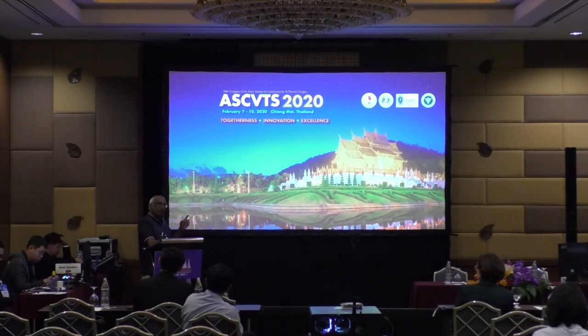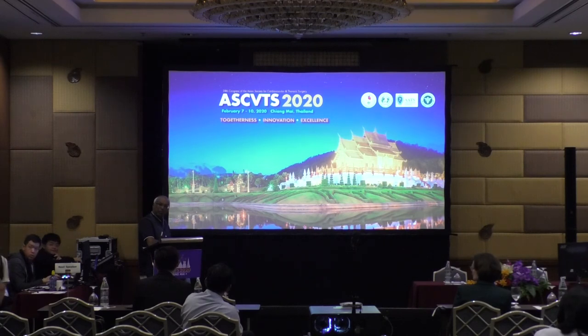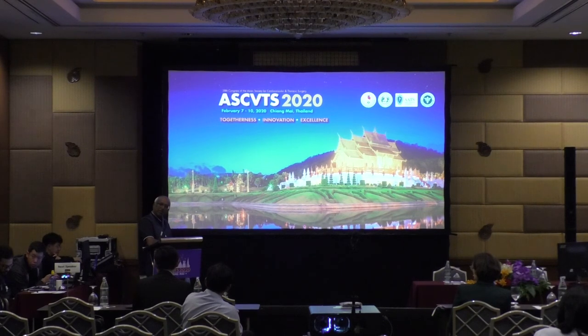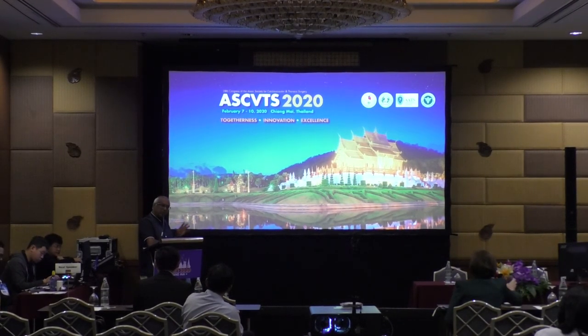I think your last three slides were more important than all the first 10 slides. The reason I say that is, it is so important to understand that strain is very variable. It's not that easy. You move those regions of interest a little bit, you get a different number, right? So I think your last three slides are absolutely critical for people wanting to do strain. But have you seen apical sparing in every patient of amyloid that you have dealt with?